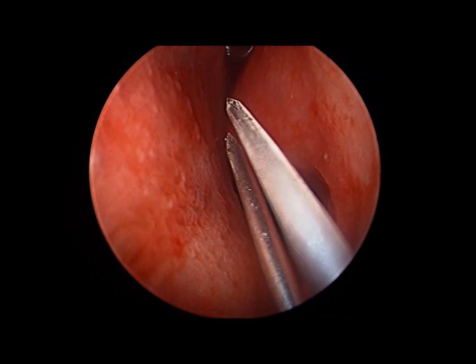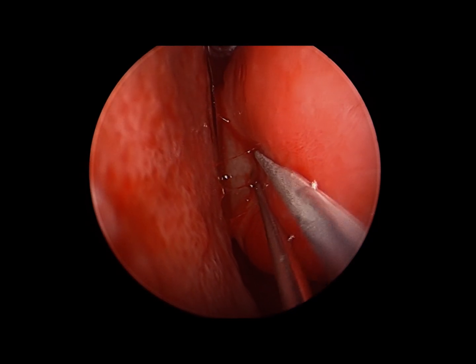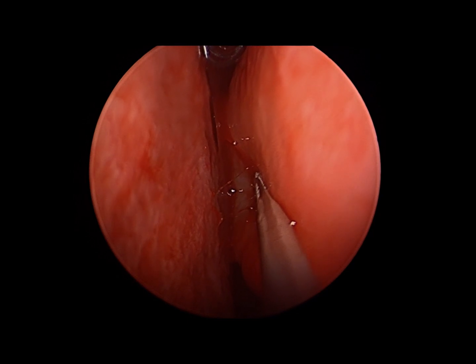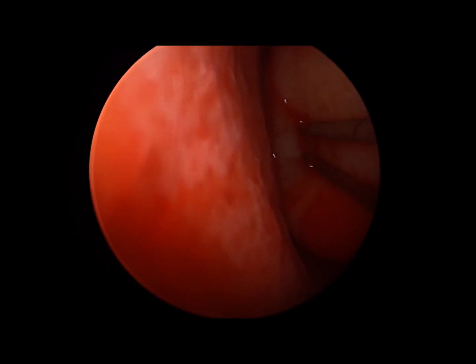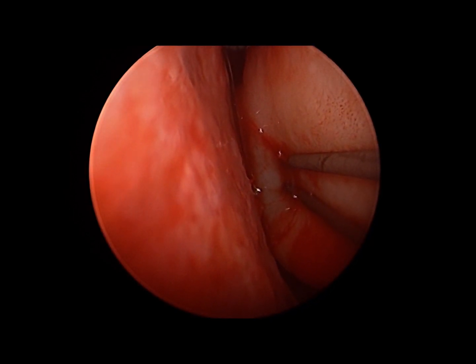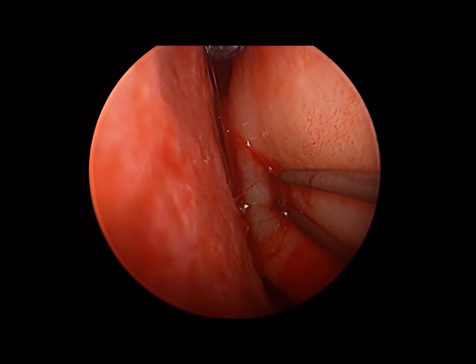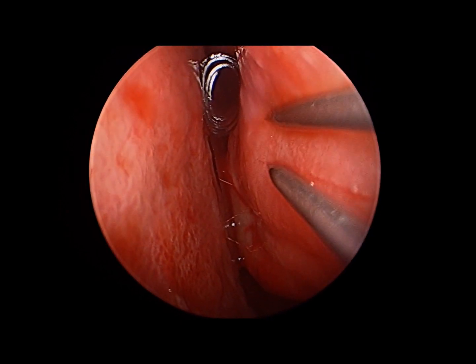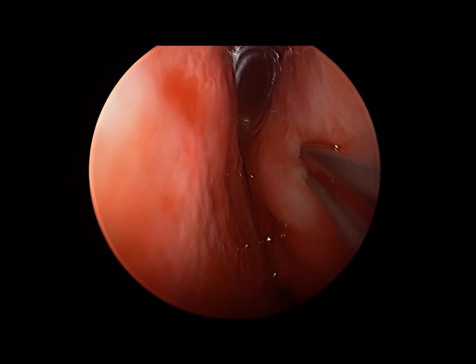This first case is performed via an Elman radiofrequency unit. The patient's inferior turbinate has been engorged with lidocaine — saline could be utilized as well. These devices work best in a fluid-filled environment, so the turbinate has been swelled up with injection. We will treat it typically in the mid portion, passing posteriorly, then anterior inferior and anterior superior.